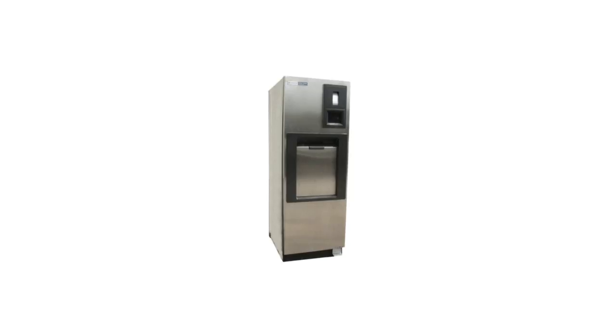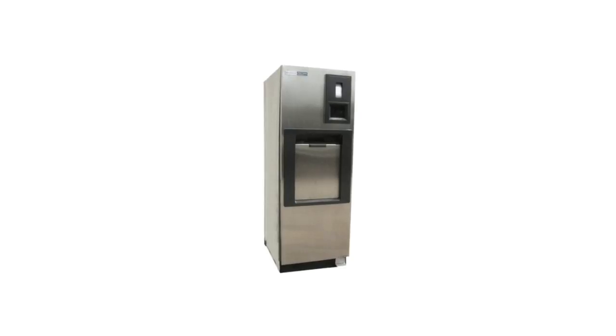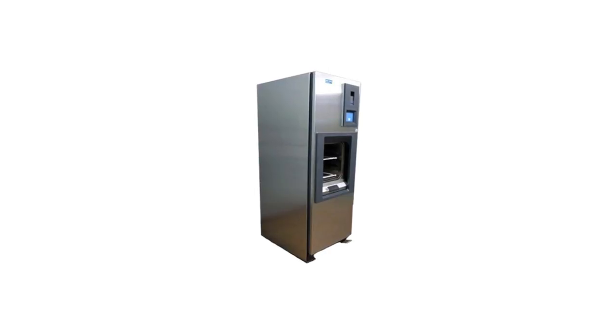The Steris V120 steam sterilizer is designed for fast, efficient sterilization of heat and water resistant materials, with the same capabilities as a gravity sterilizer. It features one rack with two shelves and a vertical door, providing enough space to fit all your equipment and quickly sterilize.